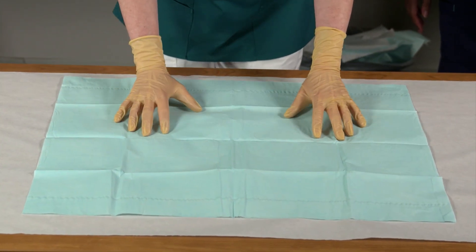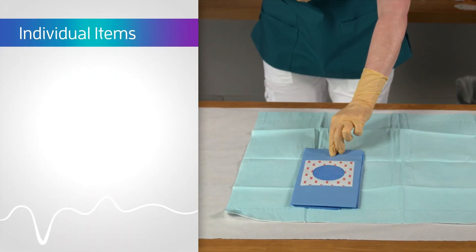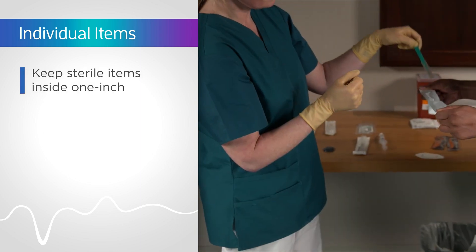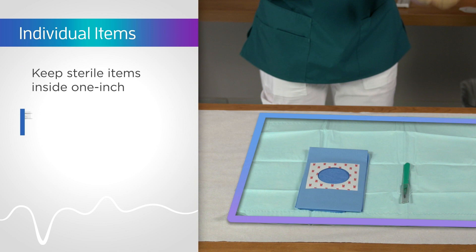The area inside the 1-inch border of the inner wrapper is considered sterile. As you add items to the sterile field, remember to keep your sterile items inside the 1-inch border of the drape. Place items that you use most often towards the center of the field.